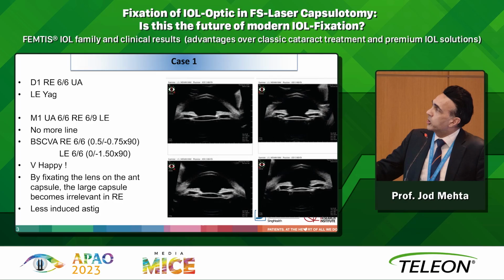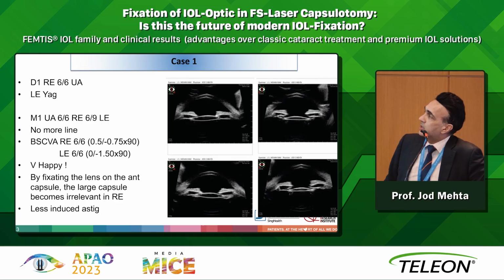This is my only slide on the Z8. Okay, so back to the case again. So we look at the case. She's 6/6, basically unaided in the right eye. Left eye basically done on the YAG.